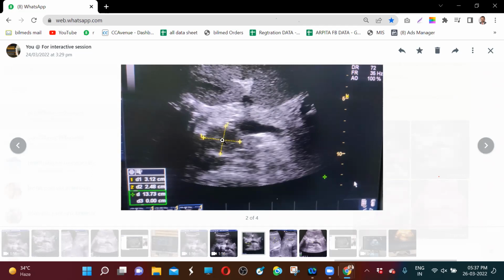So now if this is more oval and does not take color, then it is a lymph node. If it is more round, then less likely it is a lymph node, and more likely it is maybe pancreatic CA. I am not saying that this is pancreatic CA. I am giving you a DD.